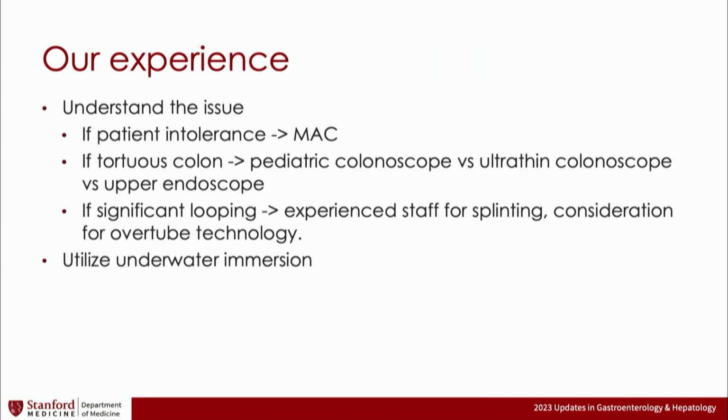In our experience, we tried to understand the issue at hand. We have a very great referral base of very experienced endoscopists who commonly document exactly the specifics of the problems that led to their incomplete colonoscopy. We use that information to try to tackle the colonoscopy appropriately. If the patient failed colonoscopy due to patient intolerance, then we try to have the patient done under deep sedation, monitored anesthesia care. If a tortuous colon was identified, then we start with the pediatric colonoscope.